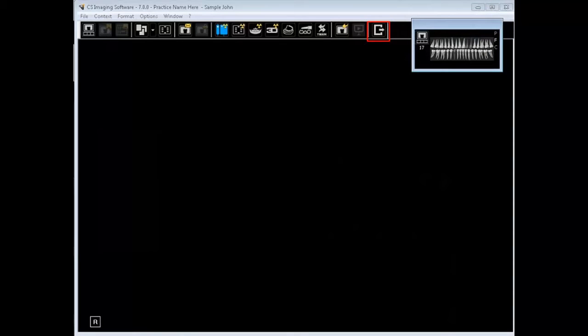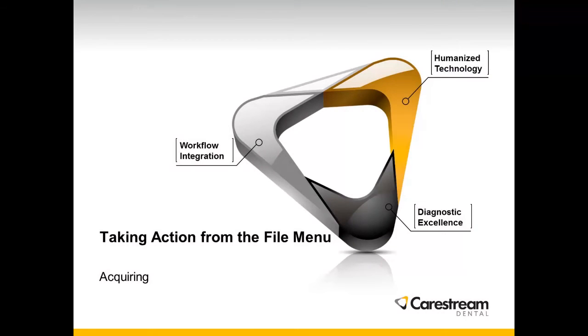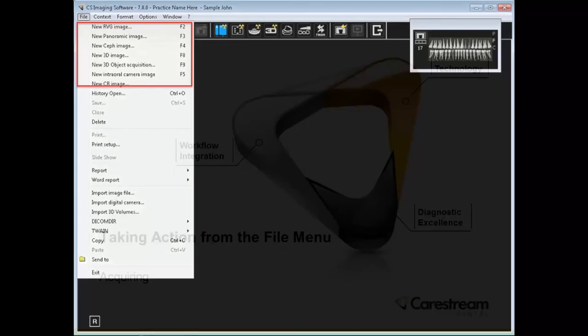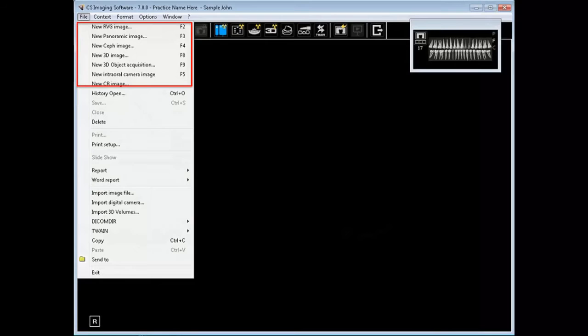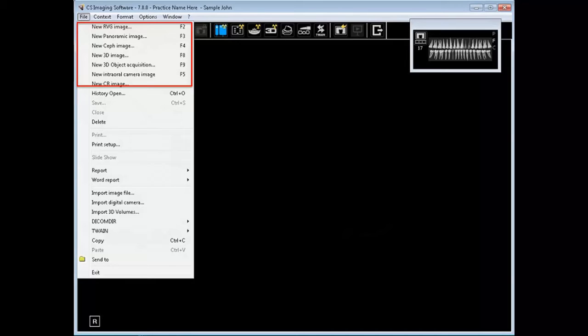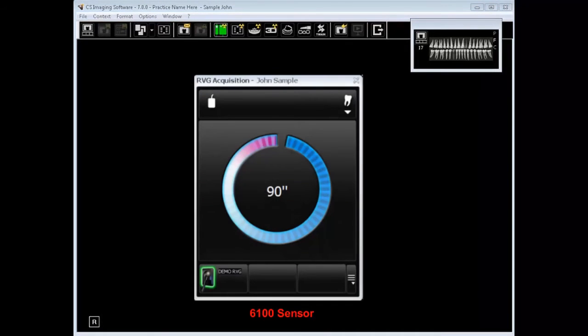And now it's time to take action from the file menu. These selections allow acquiring from various imaging devices. Here we'll focus on RVG or acquisition from a sensor.